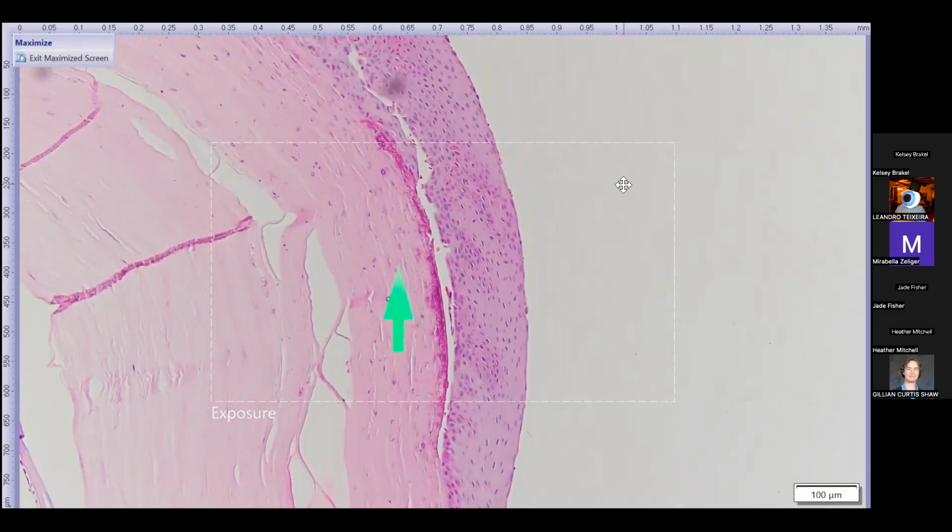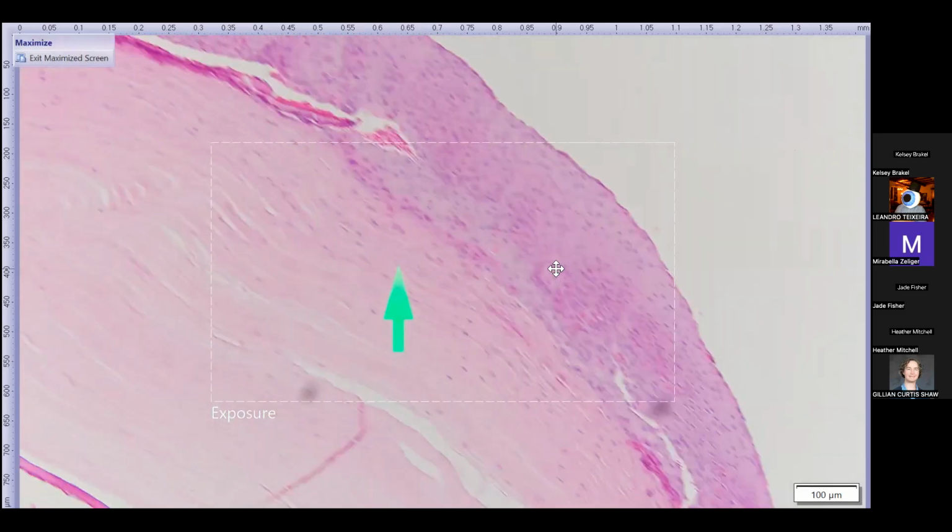If I see an ulcer, an actual area of epithelial discontinuity in our sections, I can call it an indolent ulcer. That's also what the non-adherent flaps of epithelium look like in indolent corneal ulceration. And just as they described clinically, there's this lovely superficial stromal mineralization right in that area of detachment.